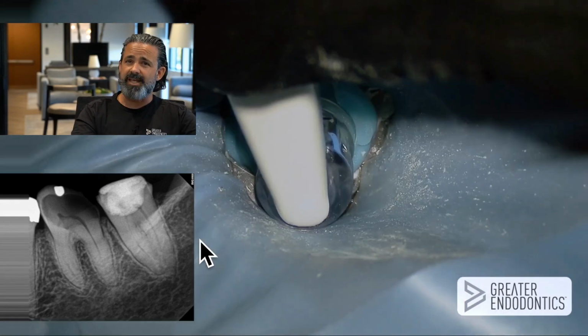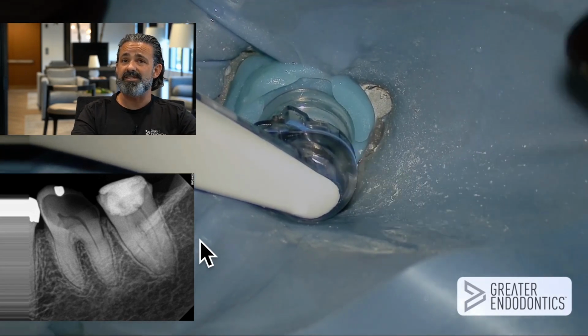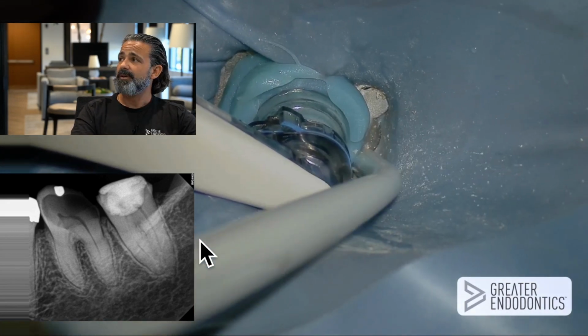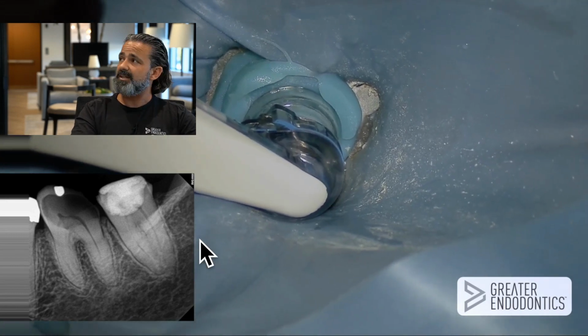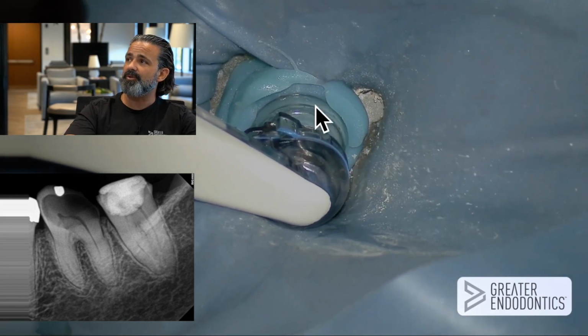And I go all tactile here, just because it's really as fast as you're seeing it. So I stopped measuring with probes. I just trust my senses. It's haptic feedback at this point. And put my sealing cap on, and then I let her rip. And, you know, the main thing is, does this technique hold? And so I'm going to be very conscious of any foaming or bubbles that can come through here.